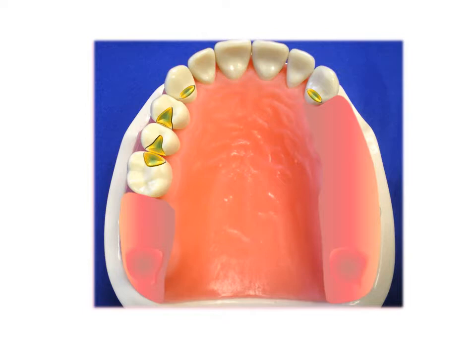Let's use the double occlusal on the mesial of the molar and distal of the bicuspid. We'll extend the rest on the bicuspid to provide some stabilization. We'll also rest the first bicuspid with an extended occlusal rest to provide resistance to lateral movement of this periodontally weakened tooth. A cingulum rest is placed on the lingual of number 6 and 11. That puts our fulcrum line as shown in the illustration.